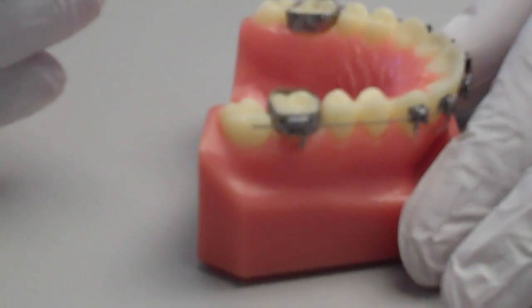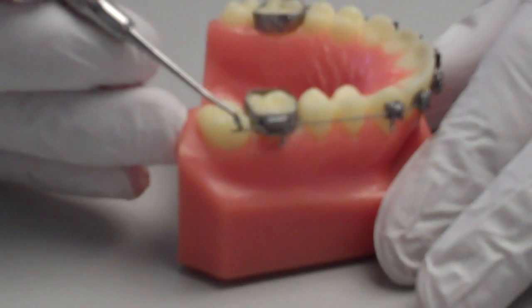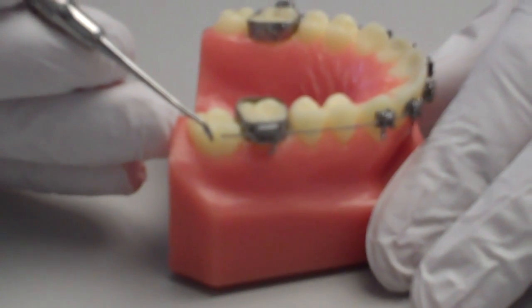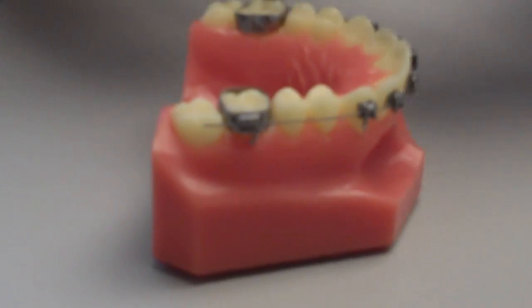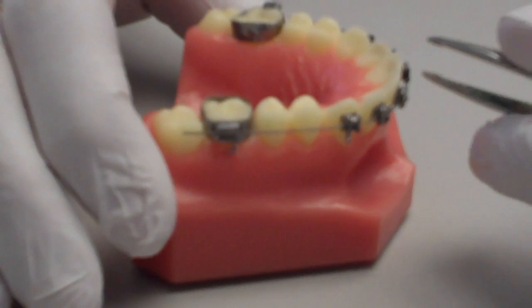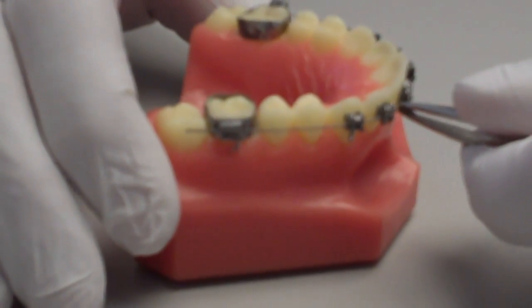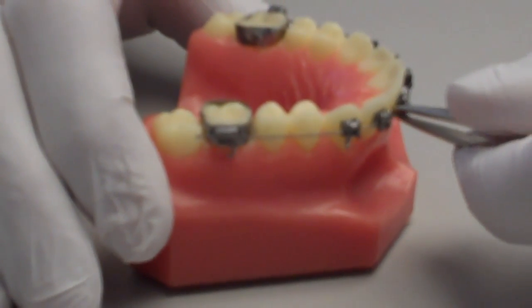Now, one of the more common problems we see with wires is that oftentimes the wire will end up being very long and sticking out of the back of the last brace, causing irritation to the cheek and the gums. One of the simpler solutions is that often the wire has actually moved to that side, and it's easy to take a small pair of tweezers and adjust that wire by grabbing the wire in the front and sliding it back to the other side, as you can see here.